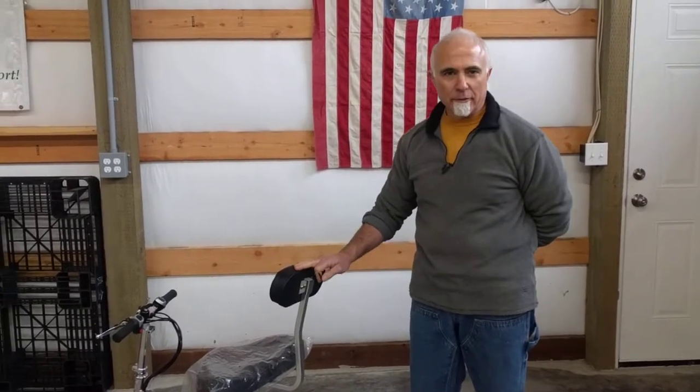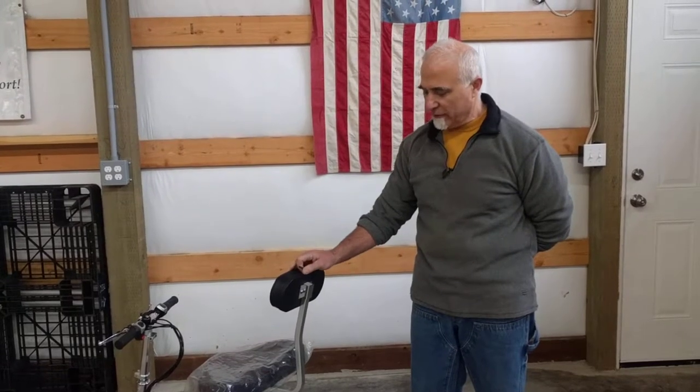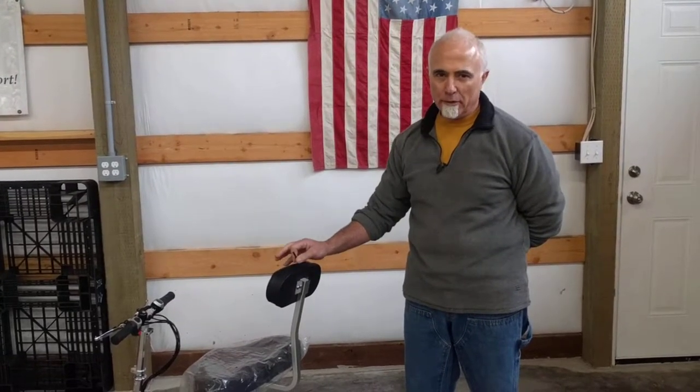Hi folks, this is Tony at TravelScoot again. Today I'm going to show you one of the features on the TravelScoot. We have a height adjustable backrest, unlike most other mobility scooters, because everybody's a little bit different.